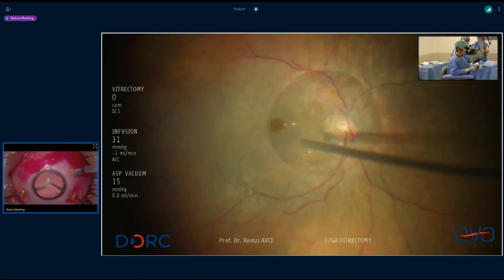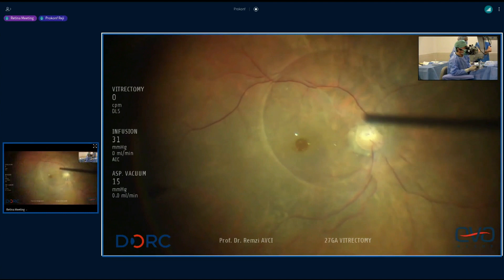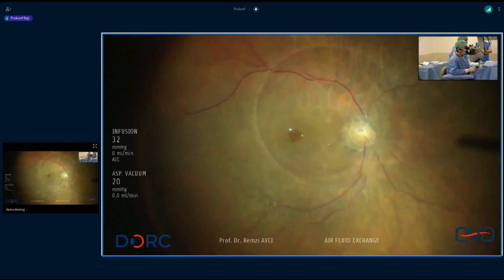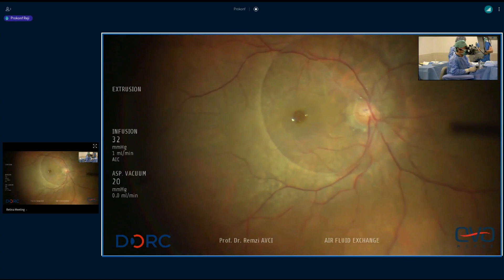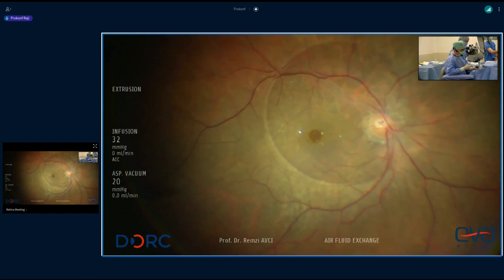Remzi, you're putting in some — if we could go to room 3 — we see you're putting a PFO bubble on the macula. As you see, we already removed the vitreous and separated the posterior hyaloid. Now we inject a PFCL bubble. This is a different staining technique that I call the crescent-shaped staining technique, to prevent staining of the inner surface of the ILM to be inverted.